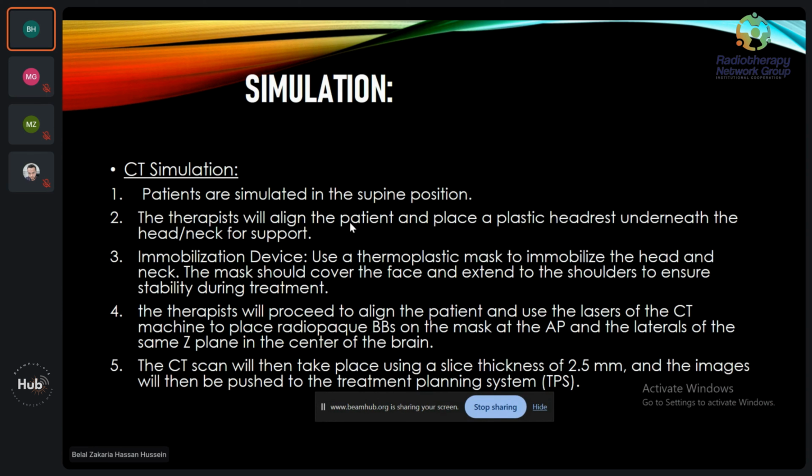The CT simulation is a very important part, and for the nasopharyngeal case, the physician and the physicist also need to give the patient the best treatment without deviation for all the treatment sessions, from end to end test. We'll start from the CT simulation.